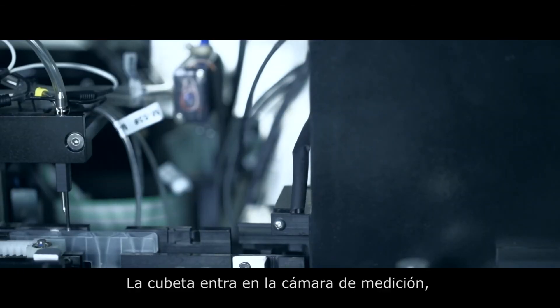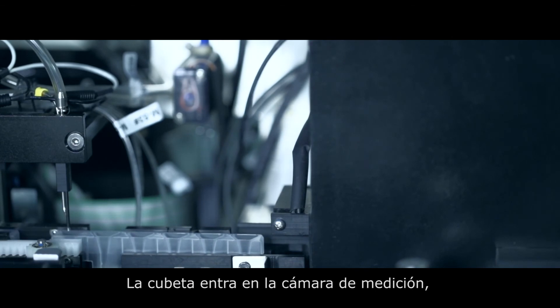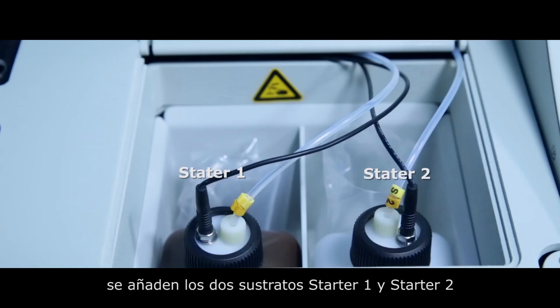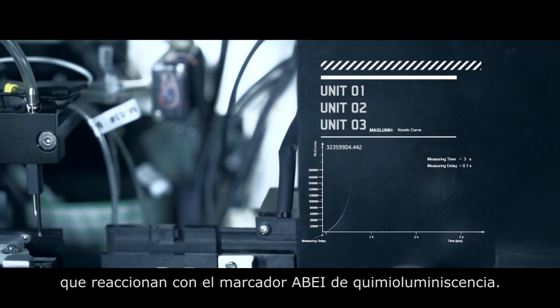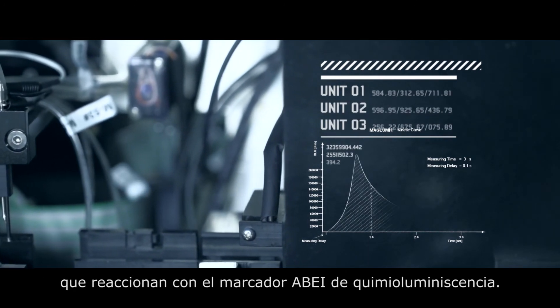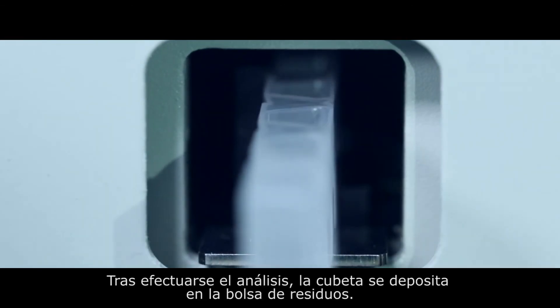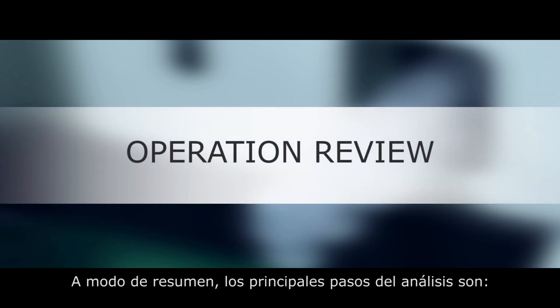Finally, the cuvette moves into the measuring chamber, which is a dark room environment. Here, two substrates — Starter One and Starter Two — are added. They react with the chemiluminescence label ABEI. After measuring, the cuvette is pushed into the waste bin and the test ends.